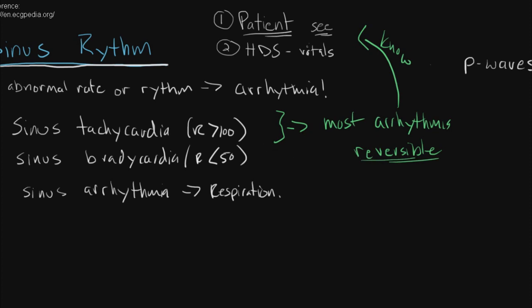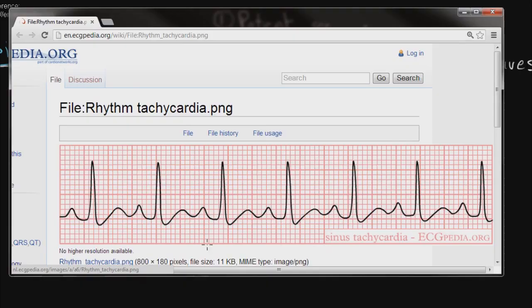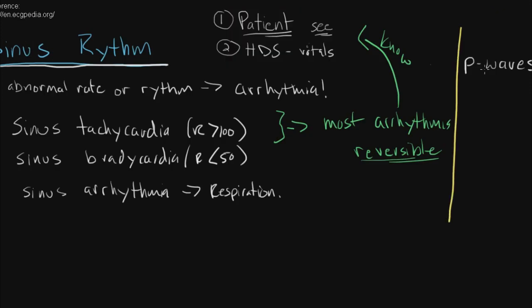Let's take a quick look at a sinus tachycardia EKG. What I have here is a rhythm of sinus tachycardia. You can see clear P-waves, a narrow QRS complex, and the rhythm is regular, but as you can see the rate is quite rapid — over 100 beats per minute. That P-wave is what tells us that this patient is having a sinus tachycardia, and on the right I've written P-wave, which is how you know you're dealing with a sinus rhythm.